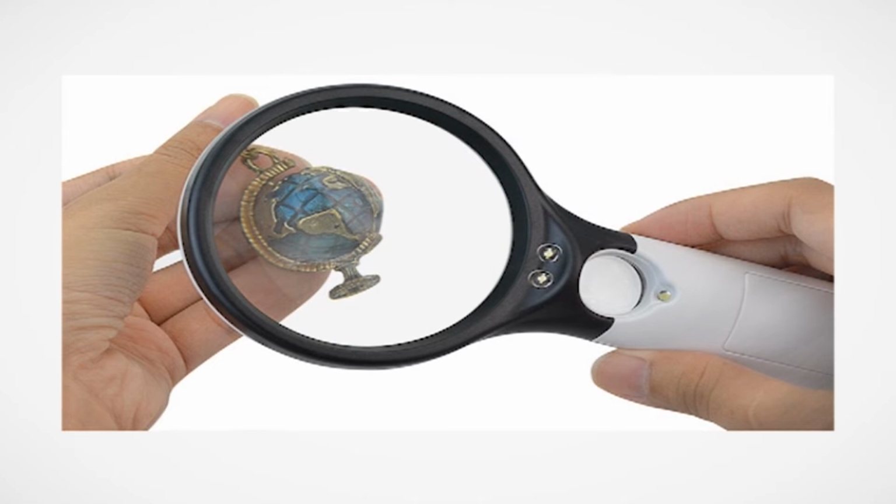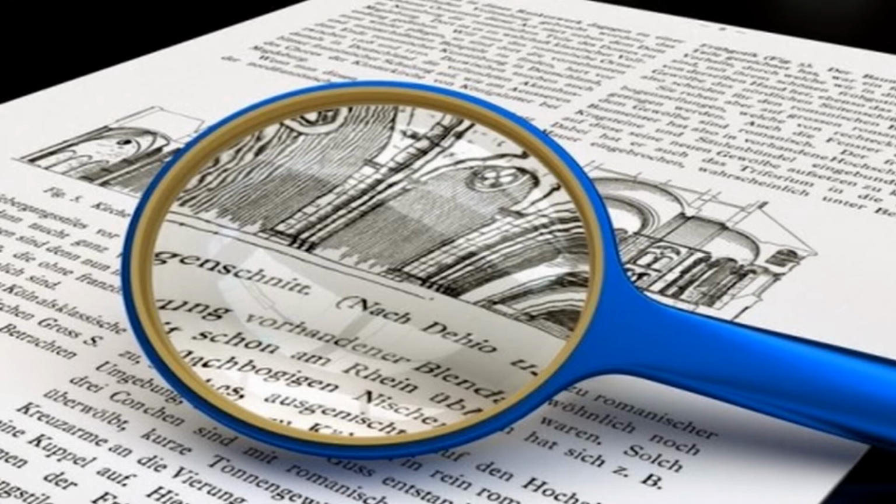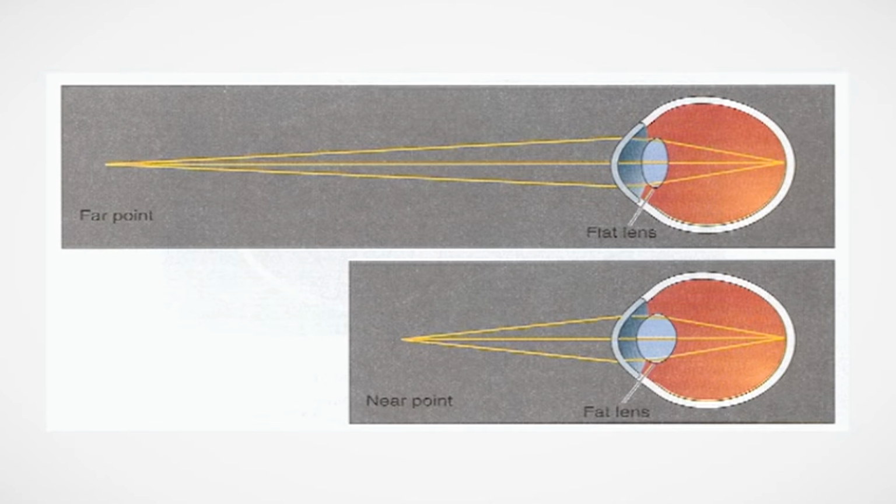Disadvantages: they must be held with one hand or sometimes with both hands. They are uncomfortable and could cause hand and arm fatigue with extended use. The reduced field of view also slows down reading. They must be held at the correct focal distance for maximum power.